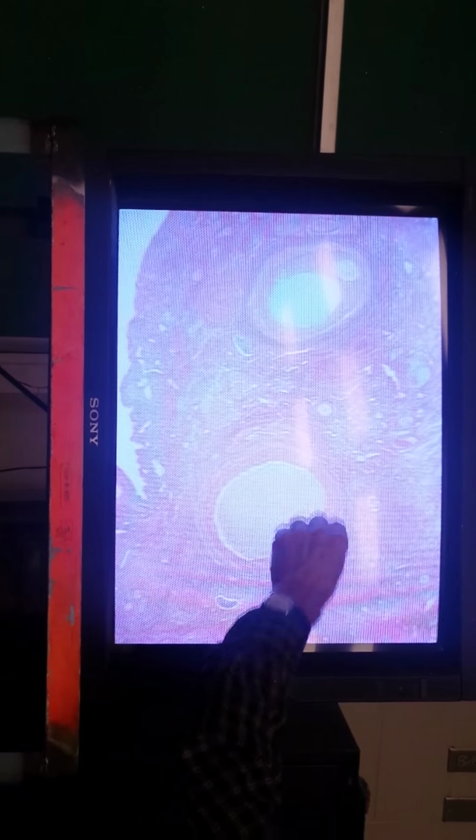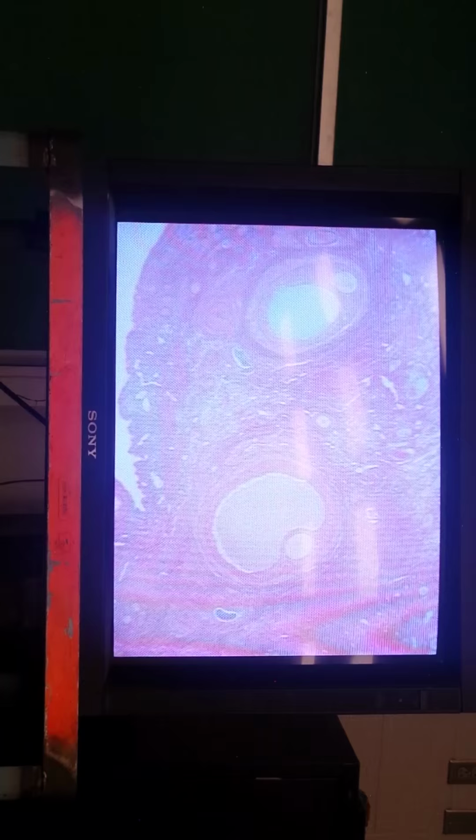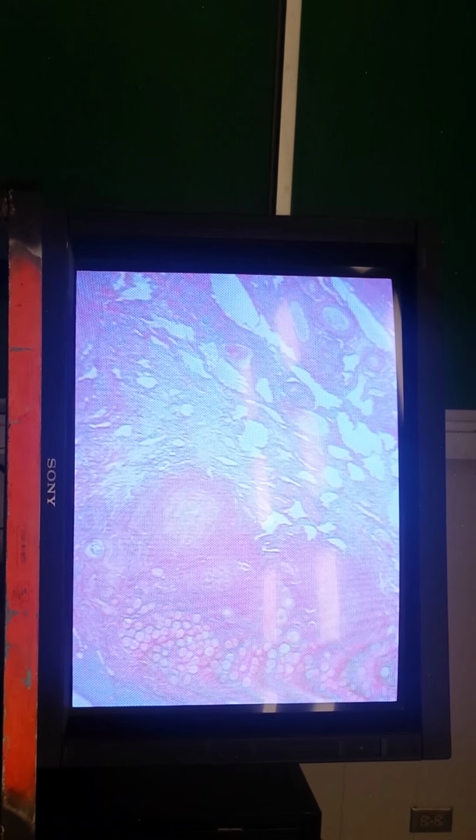What are these cells around it called? They're going to be released with it in ovulation. Yeah, that's the corona radiata. The corona radiata is going to go with the oocyte when it pops. Now, we don't have one on the slide, but if we did, what is the ruptured follicle called? Corpus hemorrhagicum. And then what causes ovulation and the formation of the corpus luteum? What hormone? LH. LH causes that.